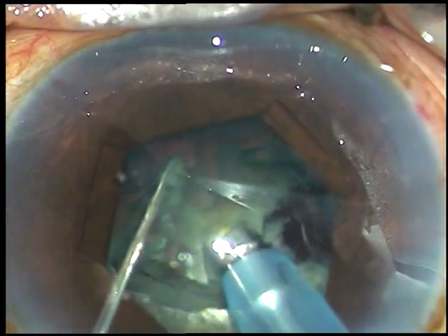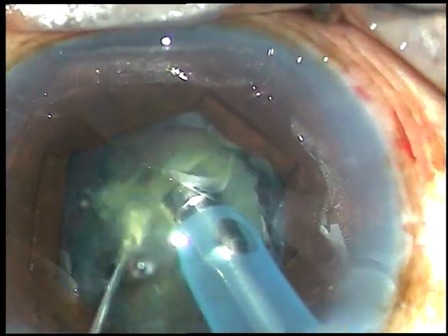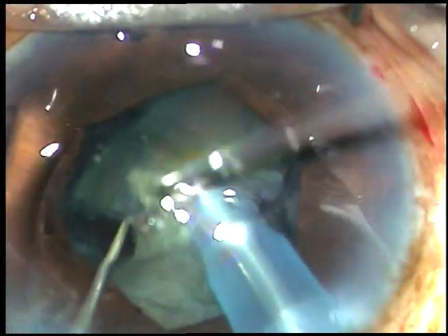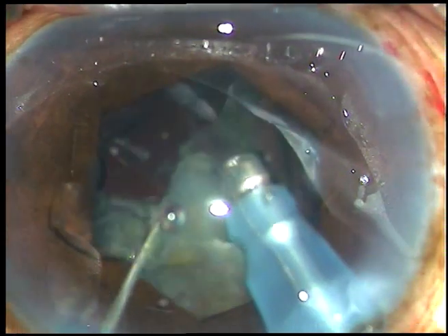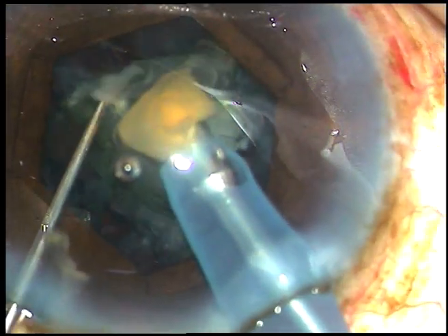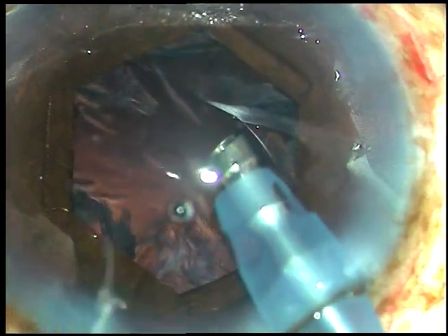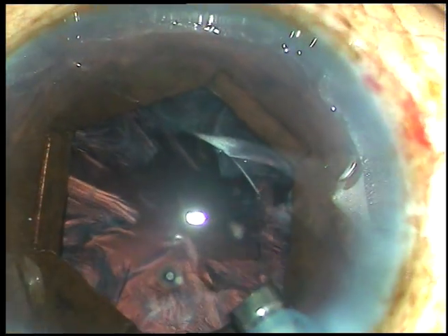I find it so simple and so easy to chop this nucleus that I no longer make a trench. As I chop, each nuclear fragment is being emulsified at that very moment. Chop it to make the nuclear fragment free and emulsify the piece, then go to the next bigger piece, chop it, emulsify. Phaco power used in this case is 65%, flow rate is 45 ml per minute, vacuum is 450 mmHg. This is the Optix Catarix 3 phaco machine. This is the last portion of the nucleus and this is the epinucleus — see the followability. All the nuclear fragments have been removed.